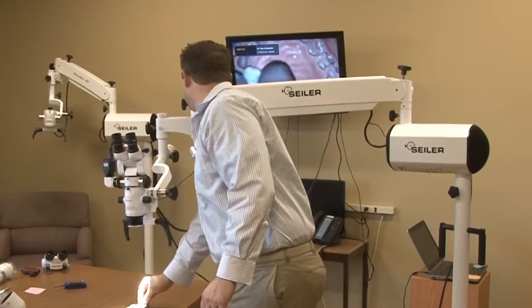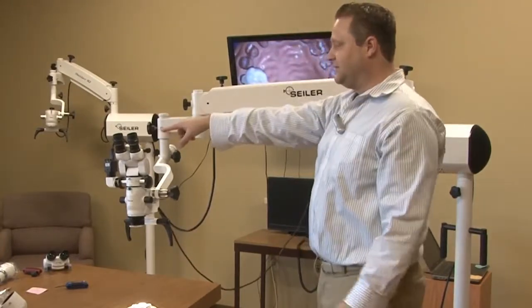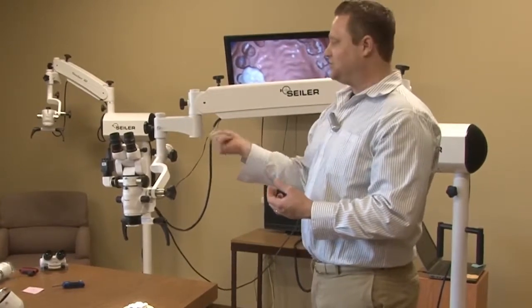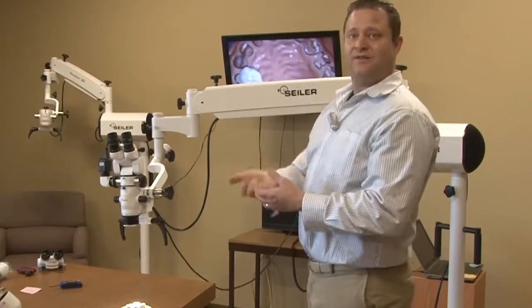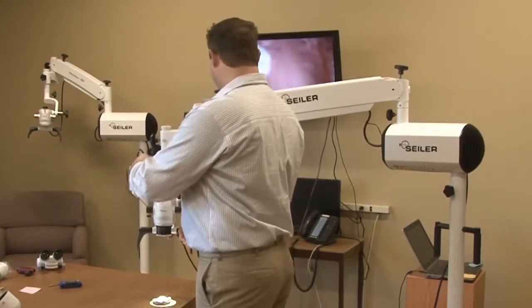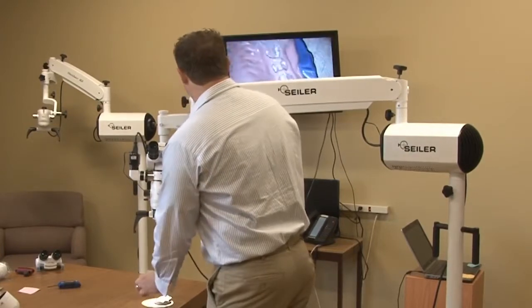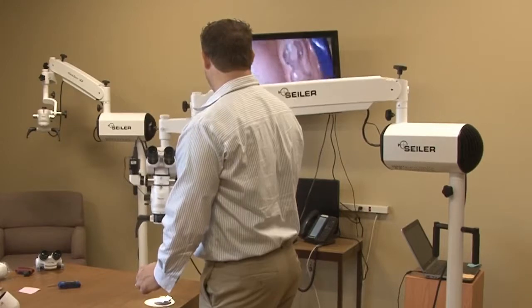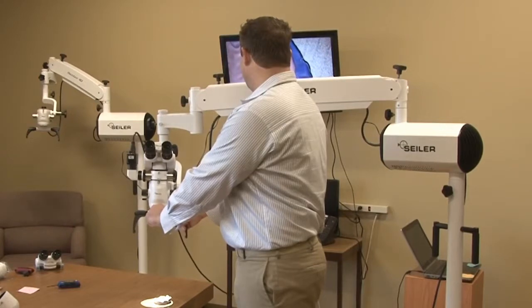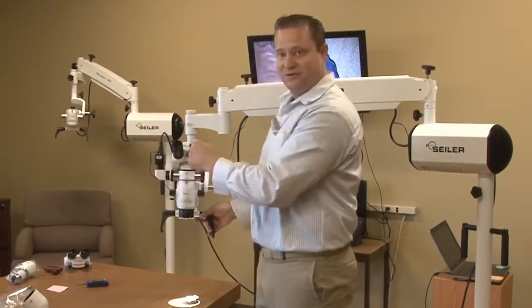Now what we want to do is make sure the source of that monitor is going to be the same source as the HD. It's just like any kind of cable — DVD — just make sure if this is plugged into source one, that it's on source one. So then what I have up here is going to be exactly what I see through the microscope. As you can see, the HD 1080p — beautiful imaging. What you're seeing through the microscope is going to be exactly what you see up on the monitor.